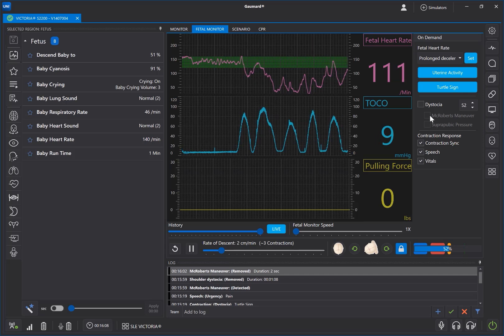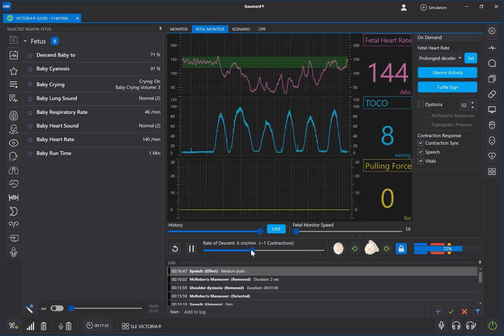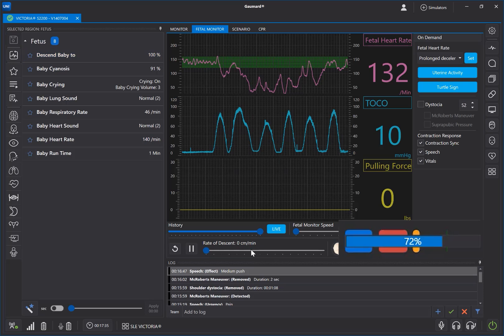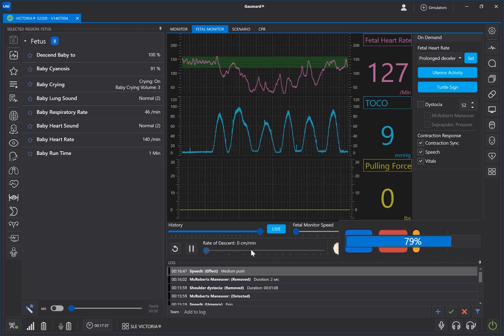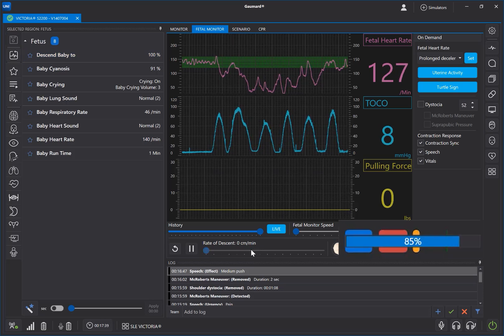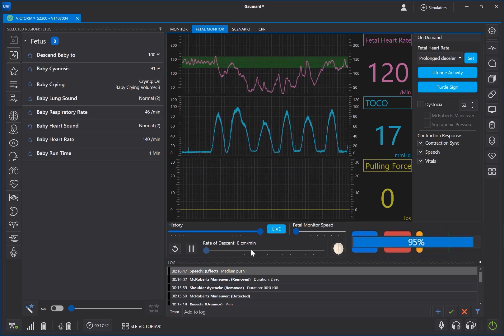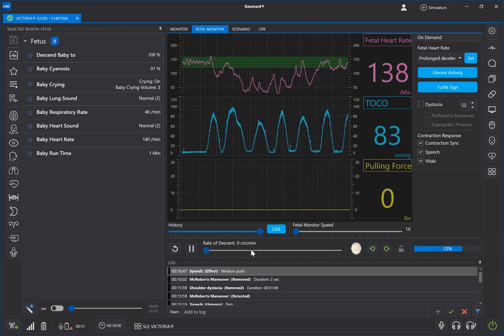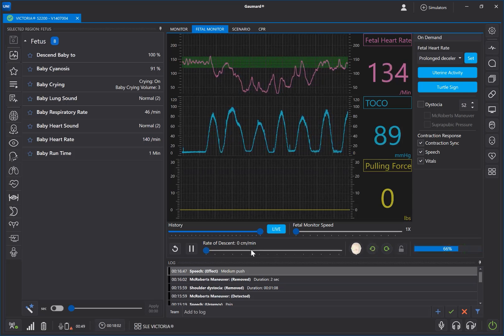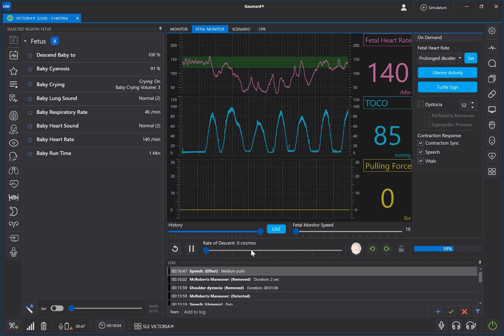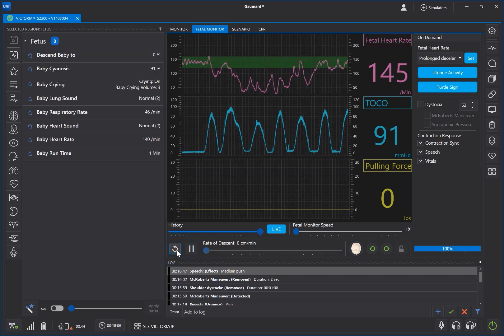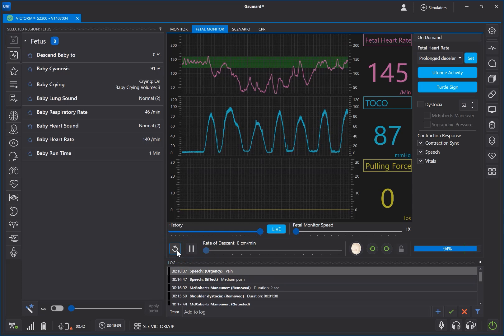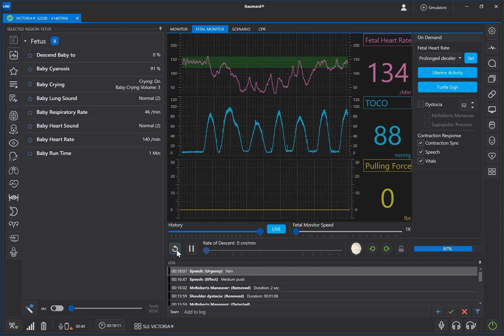If the software is not configured to automatically detect interventions, you can manually resolve the dystocia by removing the check from the box. When the labor progress passes the push-to-end threshold, the labor will progress to the end and the baby will be delivered. After the baby is delivered, press the Reset button to return the motor to the starting position. Then you're ready to connect the baby and start again.